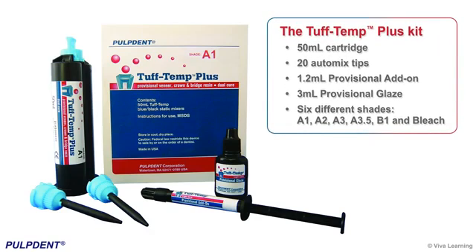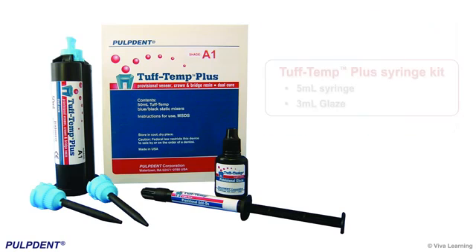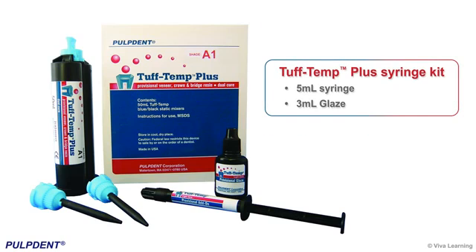The Tough Temp Plus kit includes a 50ml cartridge, 20 automix tips, 1.2ml provisional add-on, and 3ml provisional glaze. It is available in 6 different shades: A1, A2, A3, A3.5, B1, and bleach. A 5ml syringe kit with 3ml glaze is also available. Tough Temp Glaze is available separately in a 6ml bottle.